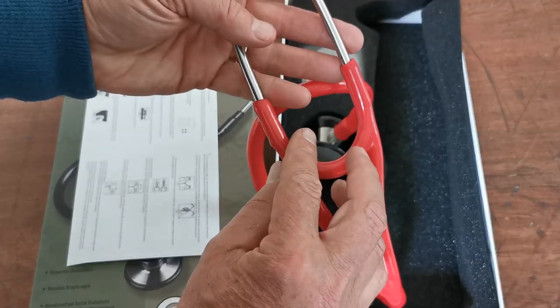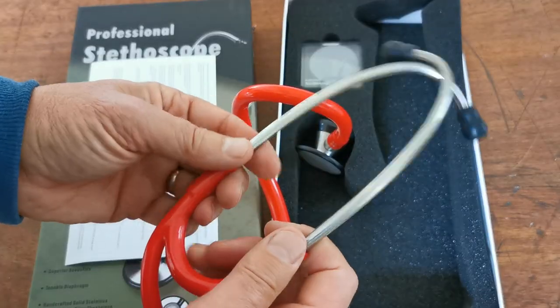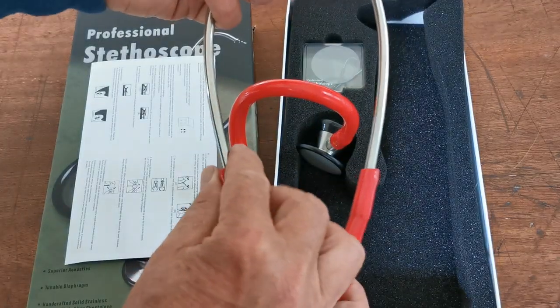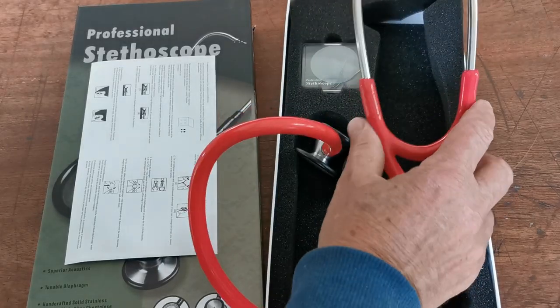Transmission of chest sounds through this tube and via the headset is excellent. The springing on the headset is just right, the alignment absolutely perfect, and it comes supplied with two black pre-fitted soft ear tips already in place.